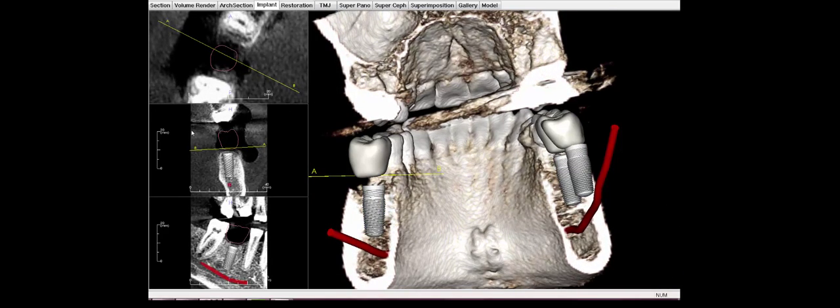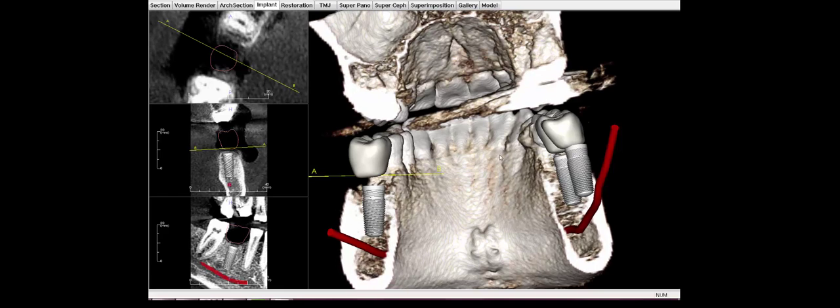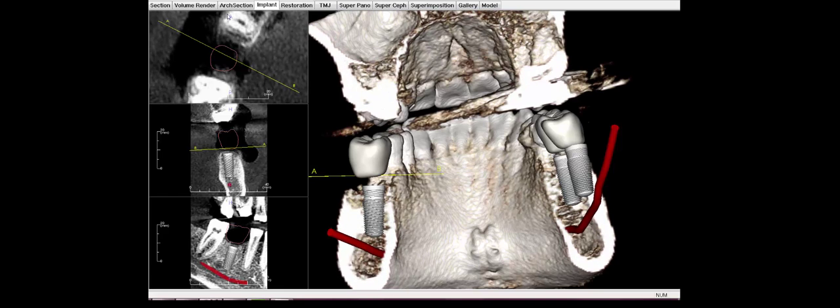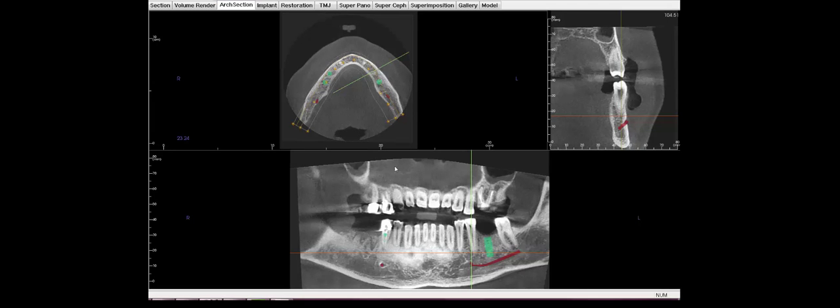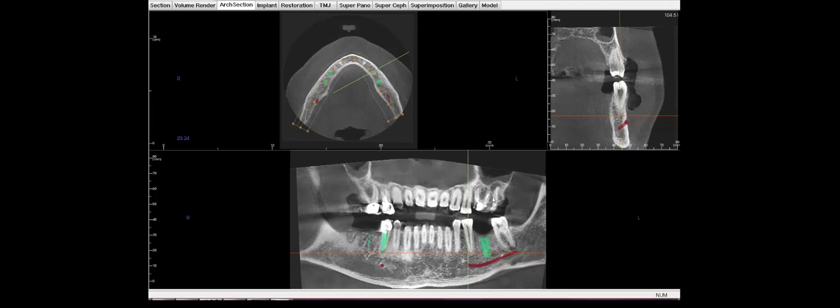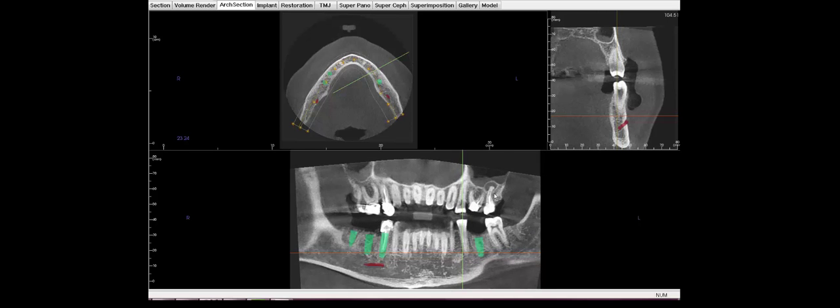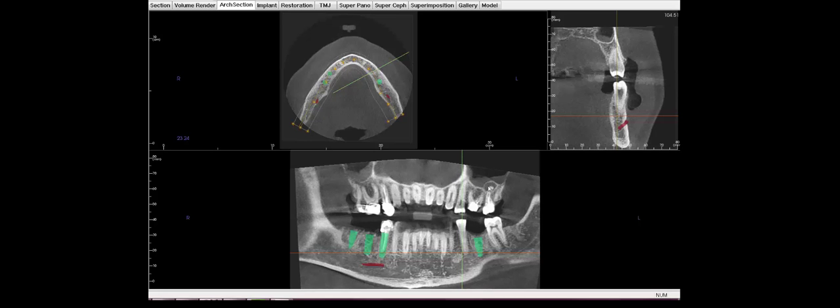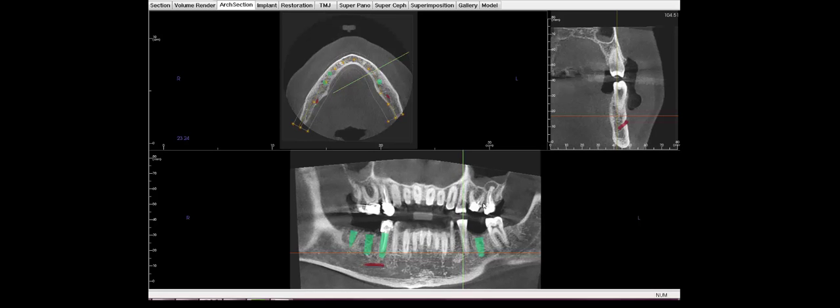Give you some idea of how the software works. In the arch section, I'll show you focus on this upper teeth. As I roll back and forth, you can actually see some of the failing root canals causing some sinus disease also.